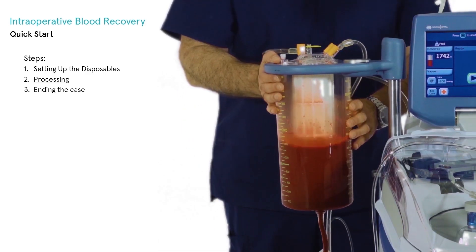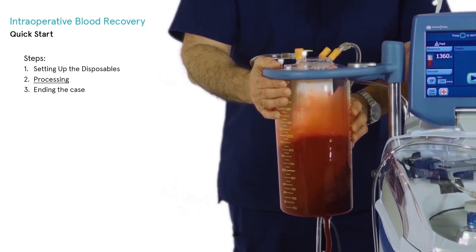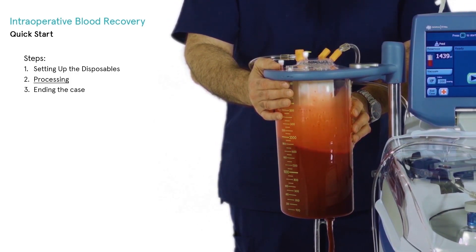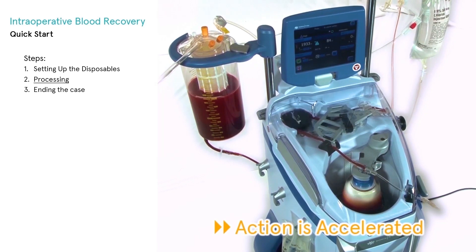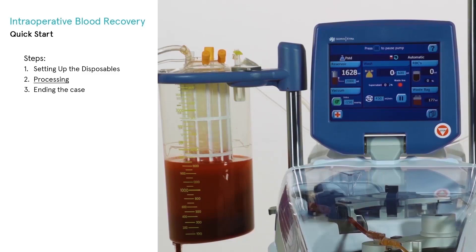One should ensure that the blood in the reservoir is regularly mixed to prevent sedimentation and to ensure that the anticoagulant is well dispersed. As blood enters the bowl during the fill phase, centrifugation concentrates the red blood cells into the bowl while supernatant components are expelled to a waste bag. This continues until the buffy coat is detected, which indicates that the bowl is properly filled with red blood cells.